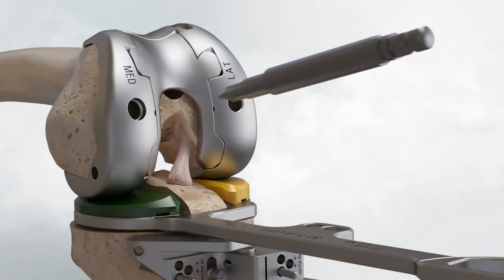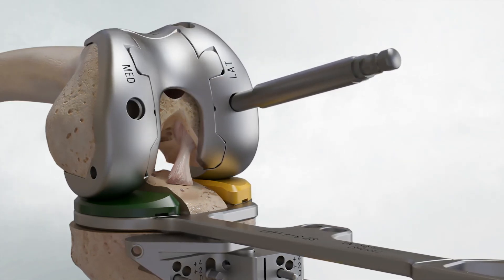Use the lug drill to prepare for the femoral lugs by drilling to the bottom of both distal holes in the femoral trial.